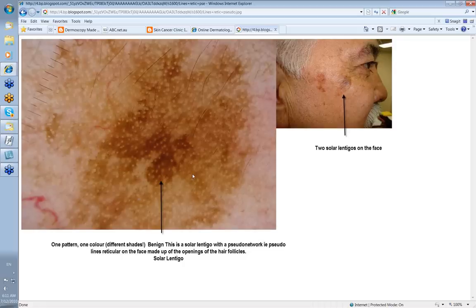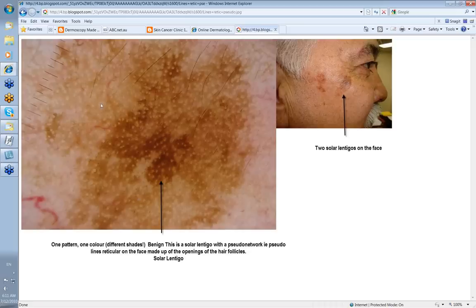So this was a solar lentigo with a pseudonetwork — pseudolines reticular on the face, made up of the openings of the hair follicles. Always remember that. This is not a melanocytic lesion; there's increased melanin deposited in keratinocytes in the skin in solar lentigo. In some there is also a bit of an increase in melanocytes along the dermoepidermal junction, but it's essentially excess melanin in keratinocytes.